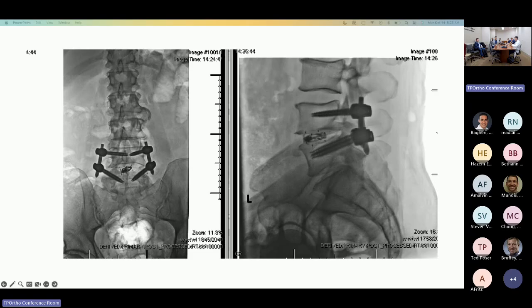That also allows me to use the microscope. And then I can watch you guys as if it's being done through loupes. It's pretty hard to see what's going on down the tube. And so I'm always looking over your shoulder and I can't really teach you and I'm more stressed out. But it's hard to have a microscope in if you've got fluoro in, because it's coming in and out, it's getting in your way. Whereas if you nav the whole thing, having a microscope in is no problem. Then I can be over the bridge on the scope, watching you guys, giving you feedback and setting it in when appropriate. Okay, a few other considerations.